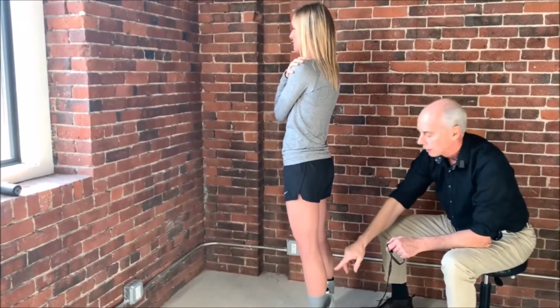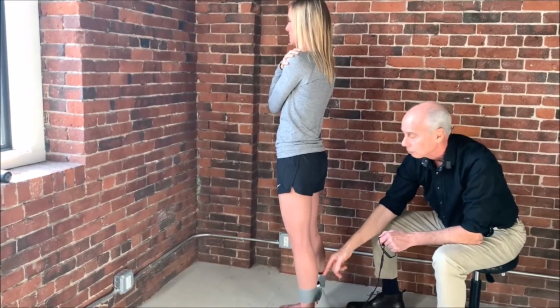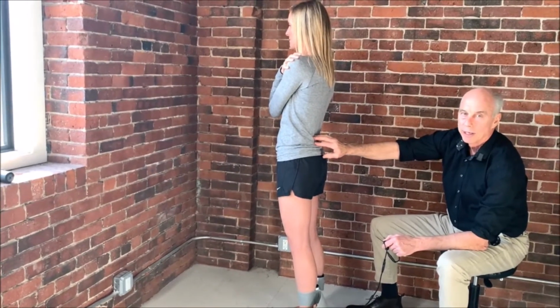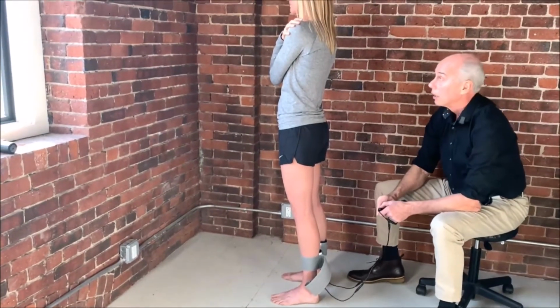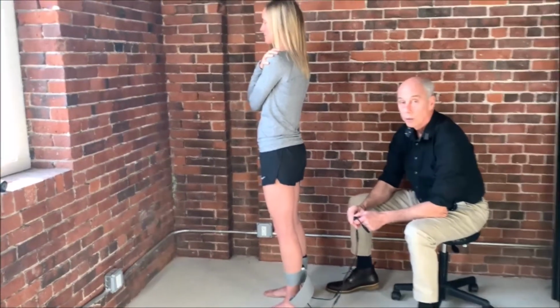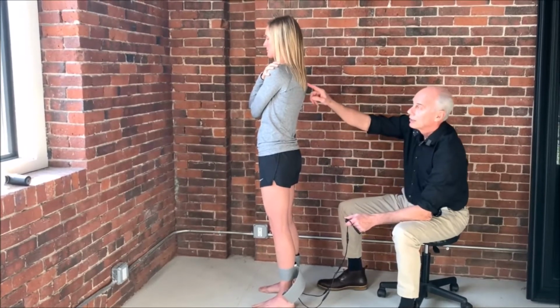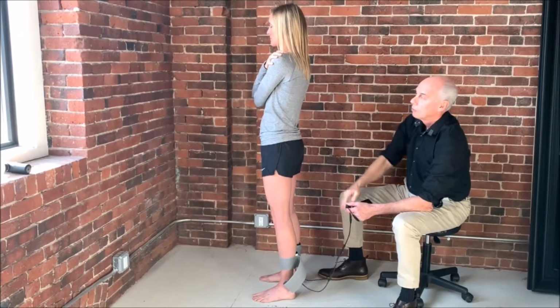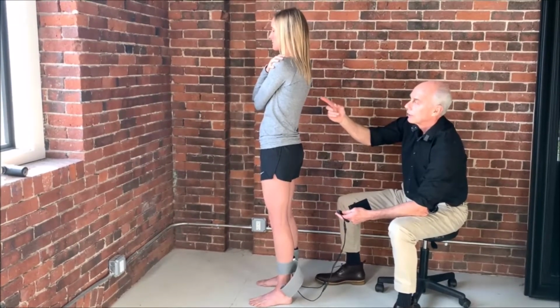So if everything's working right, you will ignore information from the spindles that are being suppressed here because these spindles would say, hey, we're fine, we're not falling forward. I don't know where you're getting that information from. So to do the test, close your eyes, balance, you just turn the motors on for 20 to 30 seconds. And I just look here to see. Again, I used to have a laser scanner, but it's very dramatic when you turn it off. So I've only had it on for 15 seconds.